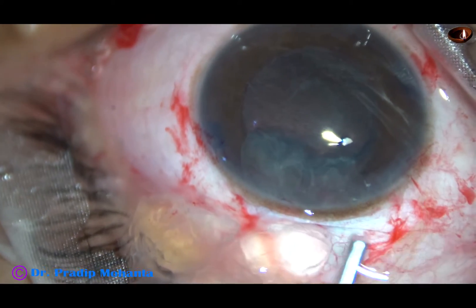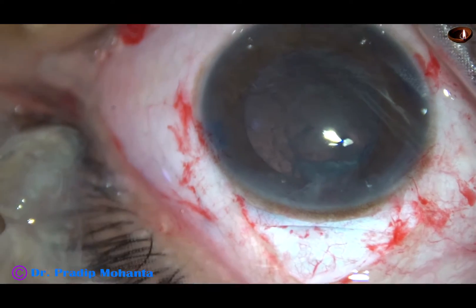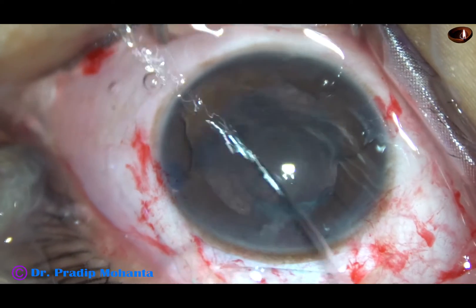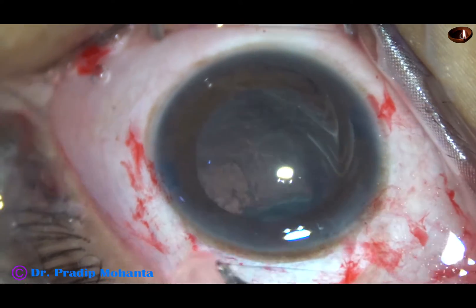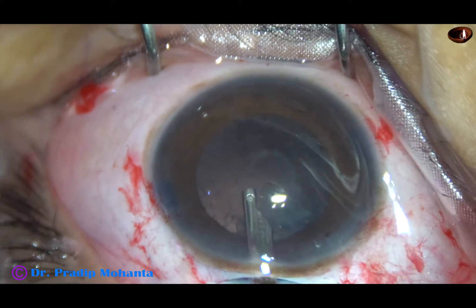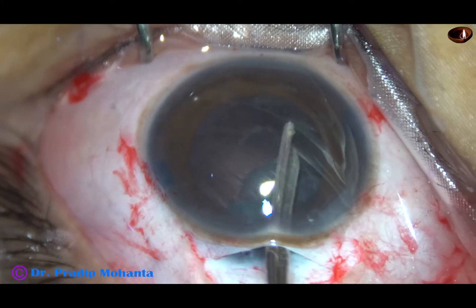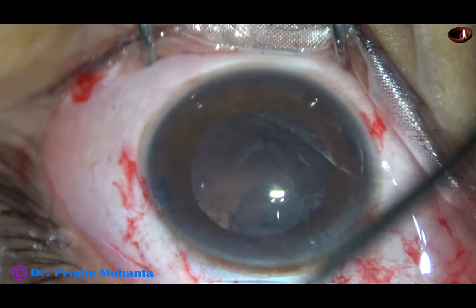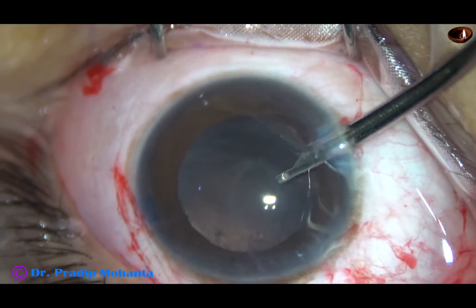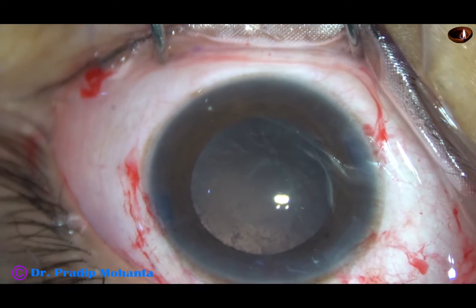Most of the nucleus has come out, and I find that the posterior capsule is intact. There is some opacity on the posterior capsule, which usually happens in posterior polar cataracts. My plan is to remove the cortical matter very safely. There are a lot of cells sticking to the posterior capsule. I am not planning to remove the opacity — there may be a thin fibrous sheet. I will not try to remove it; if necessary, I will do Nd:YAG capsulotomy after two or three months.